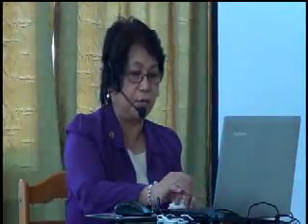So now any woman who would like to be pregnant, or is scared of being pregnant, can go to the pharmacy, pick this up, add your urine, and find out if you're pregnant or not. In 2003, they extended it into a digital pregnancy test. Now the kit will show the words pregnant or not pregnant, so it's easier. They don't have to know how to interpret the kit. This is the one we took into consideration to develop the lateral flow test.